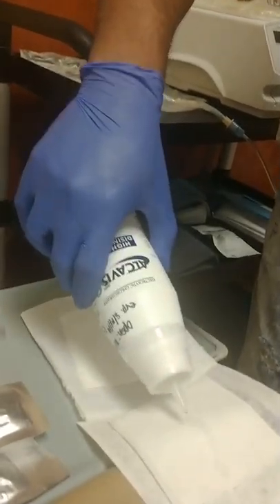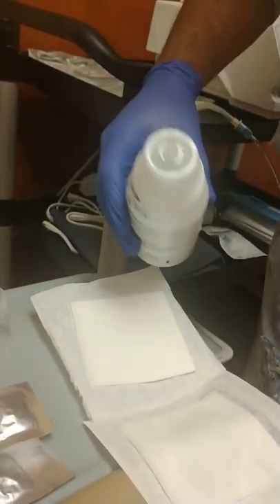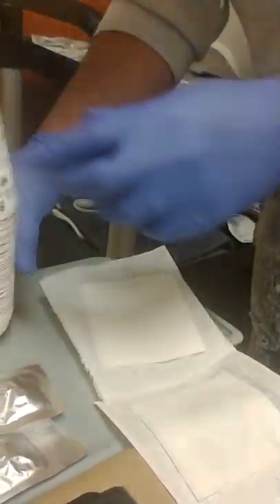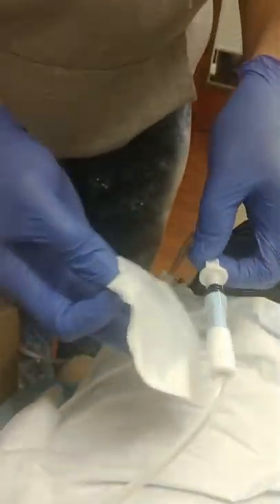So great, babe. And this is to clean the catheter before we unhook it. We have to clean it really good. Let's do this for a minute.